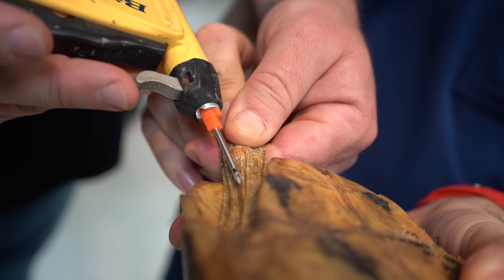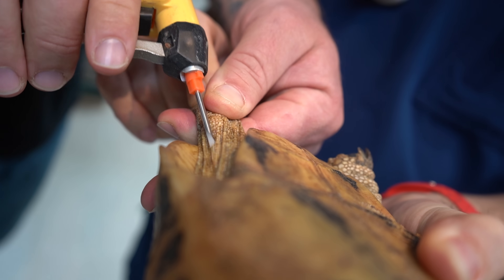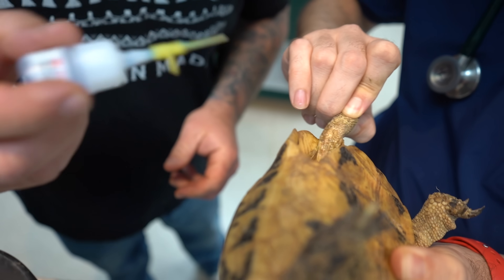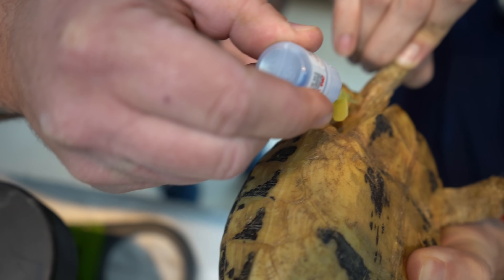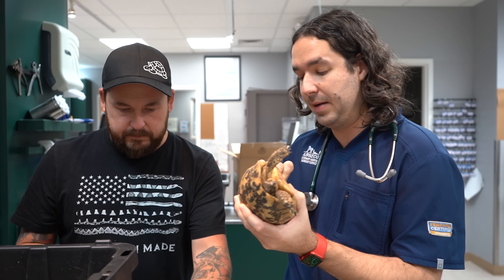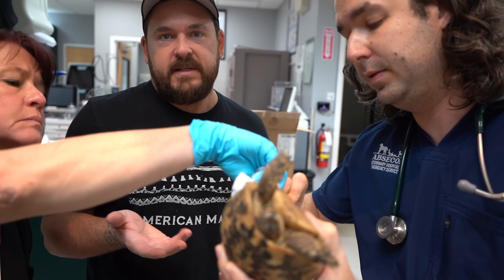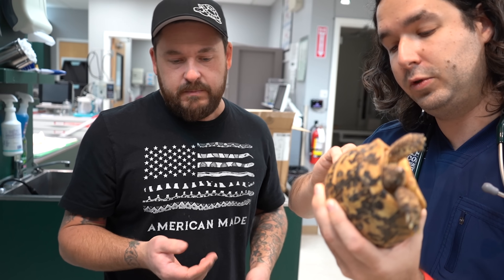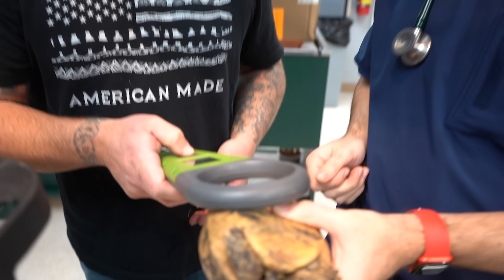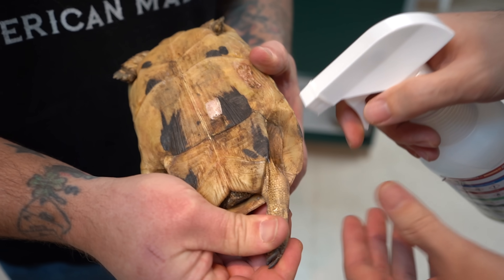Right underneath the skin — it's a very sharp needle. Just like that. That's it. That one's in. Then we have the glue right here — just don't touch the skin, just put a drop right over that area. Then we get a little gauze and push the skin together where the needle was. That prevents any bleeding that could happen — it's pretty rare but sometimes they do bleed. Then we scan it. There's our number.